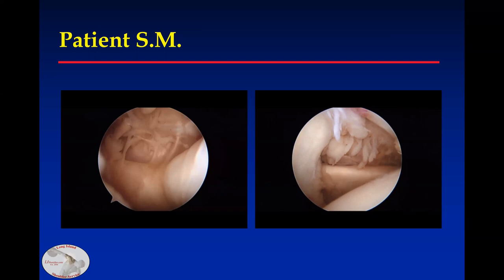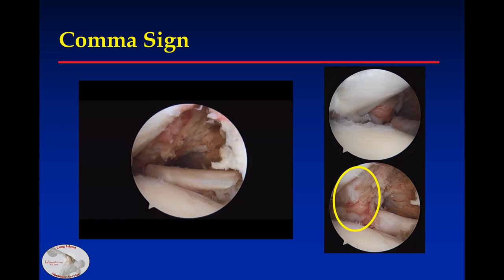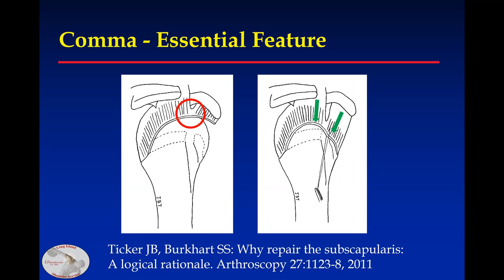This is another example in a left shoulder. When you pull the biceps out of the way, there's the comma tissue, and when you come through the cuff defect, you can bring the subscapularis laterally. This is because the comma connects the subscapularis and the supraspinatus, and when you bring the subscapularis laterally and repair it, you bring both tendons into a much better position and get a more secure repair. This is something Steve Burkhart and I spoke about and wrote about some years ago.